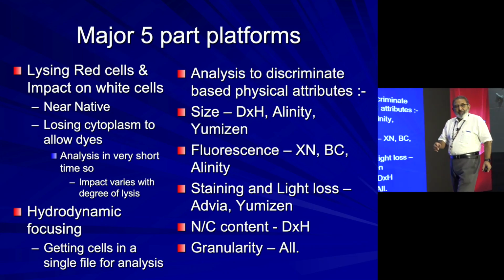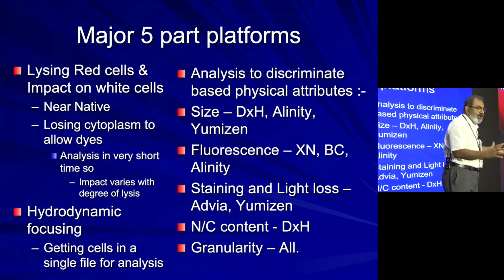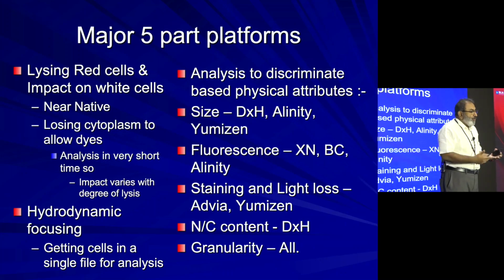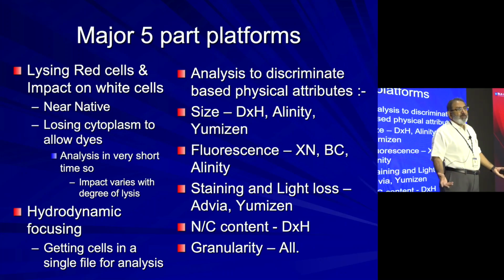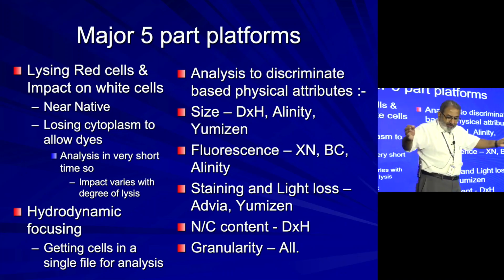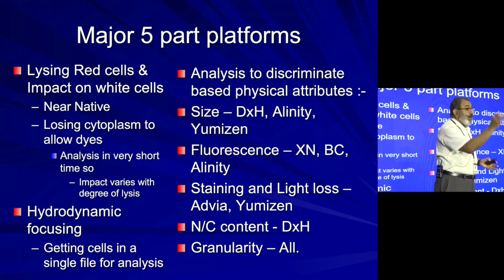Yeah. So you must realize that when we actually invest time on a cell counter, you should know what the cell counter is doing. If you don't know what the cell counter is doing, why invest time on it? So therefore, what I do is, I put it from this side, then I know exactly what's happening to the white cell in 25 seconds.